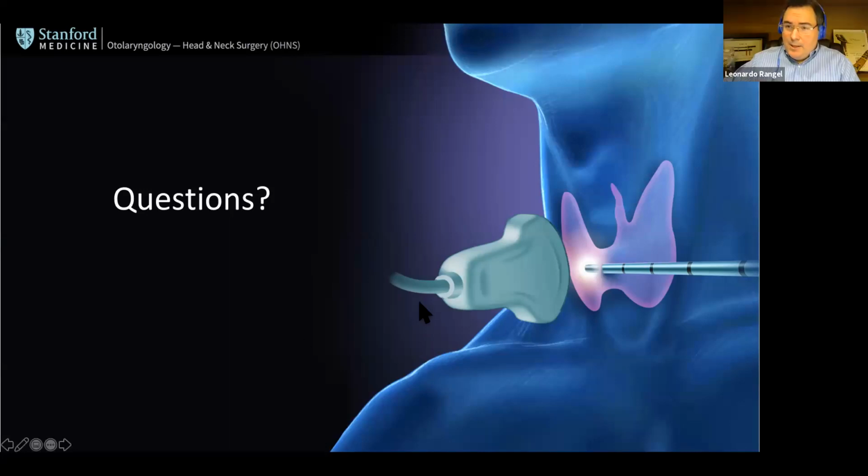Yeah, this is a question at the verge of the philosophy of radio frequency. When we talk about radio frequency and try to preserve thyroid function with minimum risks, we are actually trying to treat the nodule instead of treating the thyroid. But if we do not have a functioning thyroid, or a very multinodular goiter with almost countless nodules, we are really not treating the thyroid.